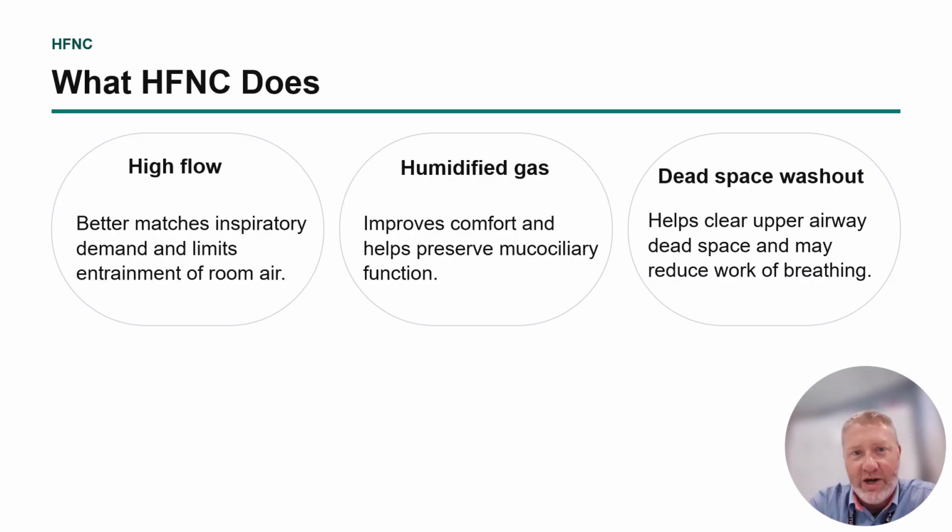But they are not true high flow nasal cannula devices because in order to be a true high flow nasal cannula device, you have to be able to go up to either 40, 50, 60, 70 liters a minute. You have to have a heated humidification system with it, and then you have to have a way to dial in the FiO2, so an oxygen blender. And unless you have one on the rig, you're not going to be able to know what FiO2 a patient is getting with one of those Salter high flows.